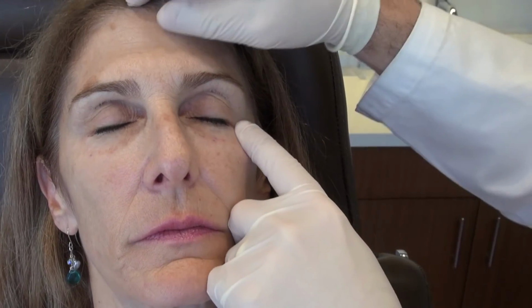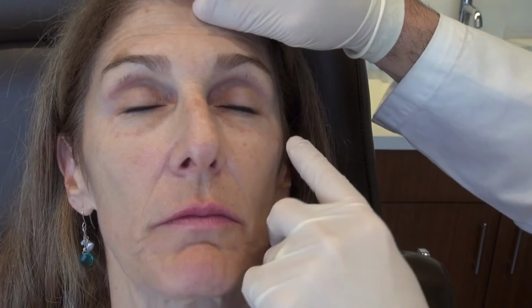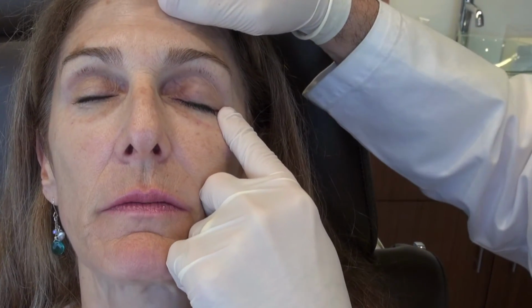How is this in terms of discomfort, Linda? It's not uncomfortable at all, actually. Okay, it's not a big deal, right? No, totally not a big deal. All right, open your eyes. That's really good. I think that's pretty perfect.